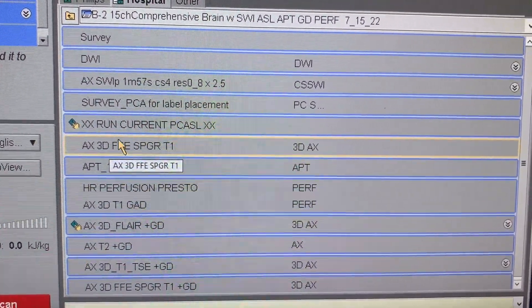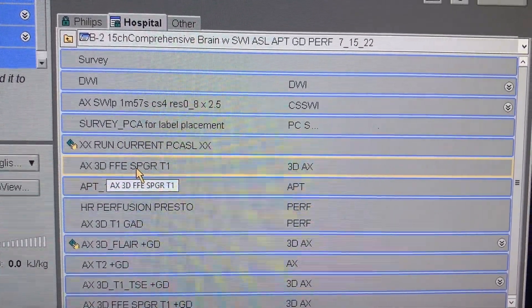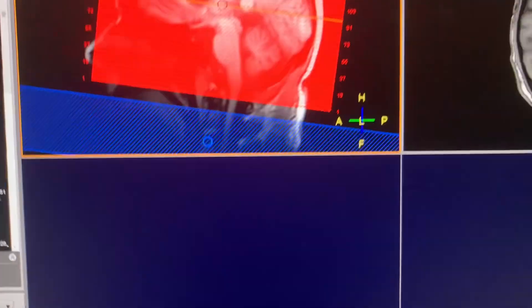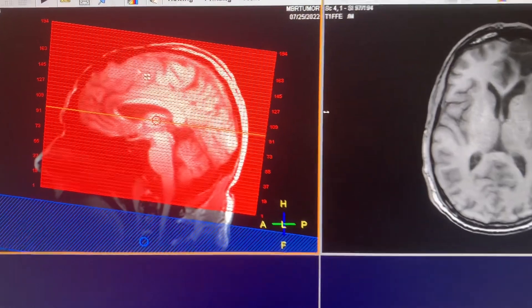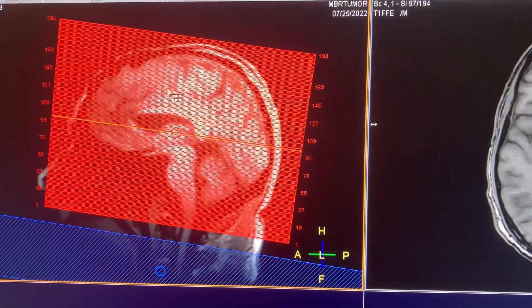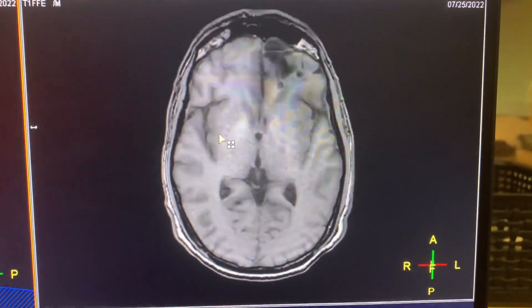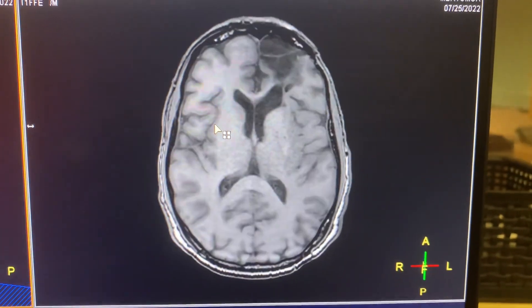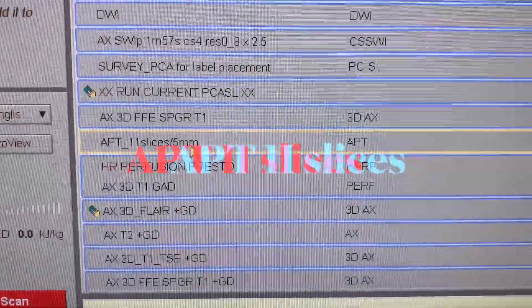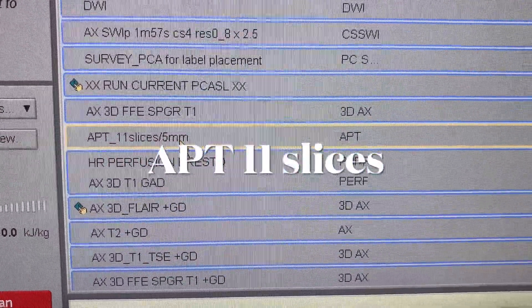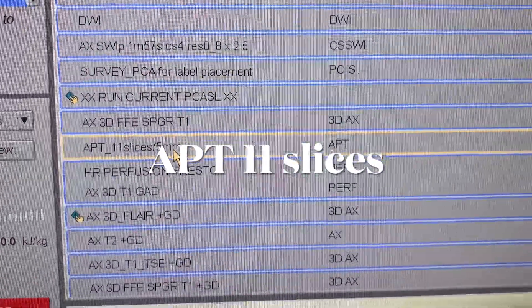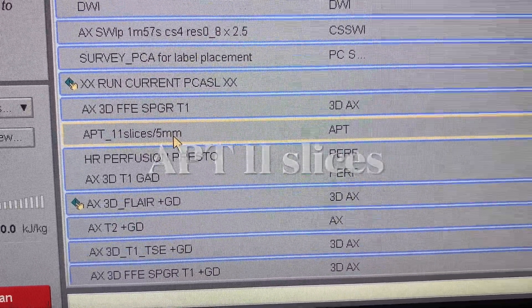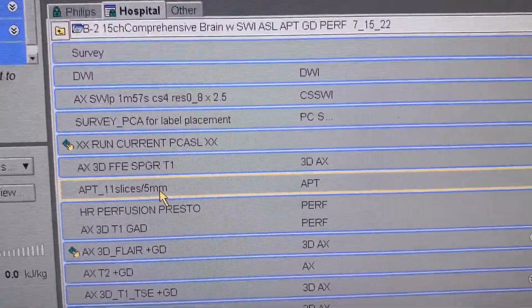Next is the axial 3D FFE — again a routine sequence. Here's how you set it up: cover the entire brain. Here's your final result. Moving on.